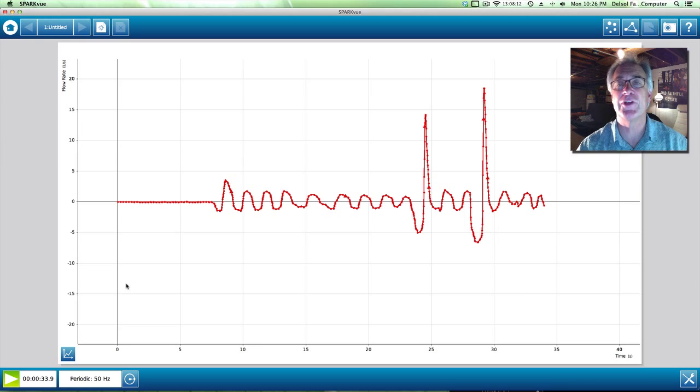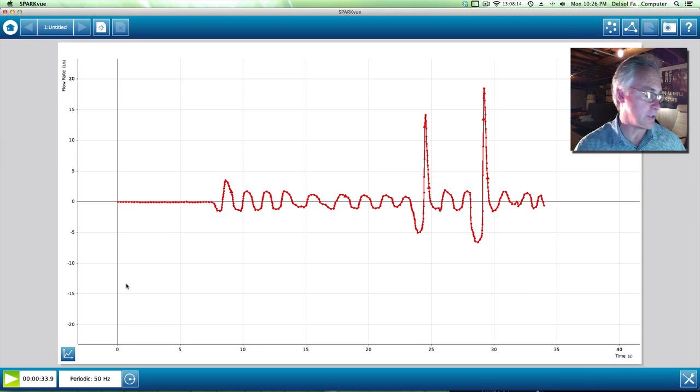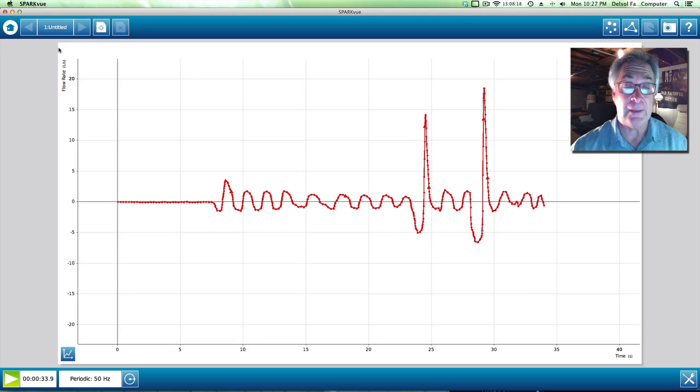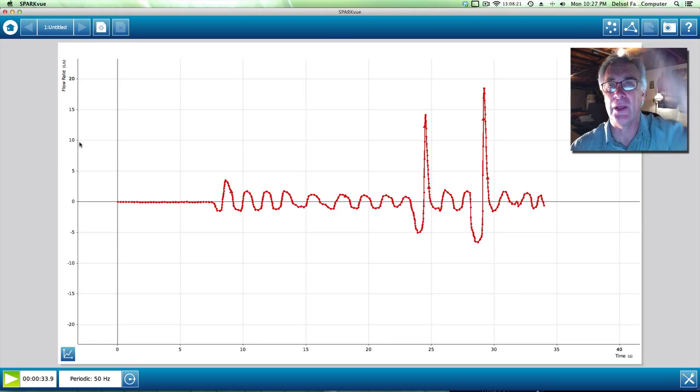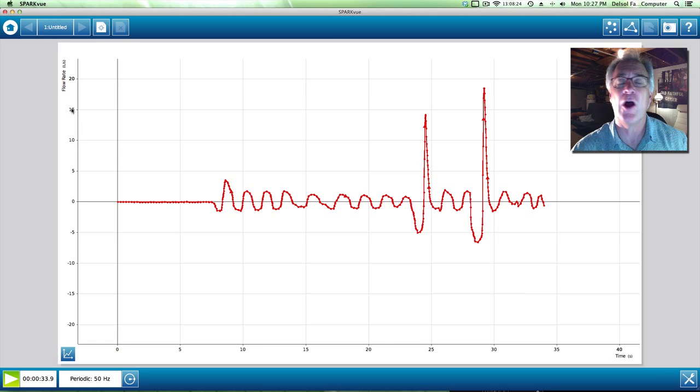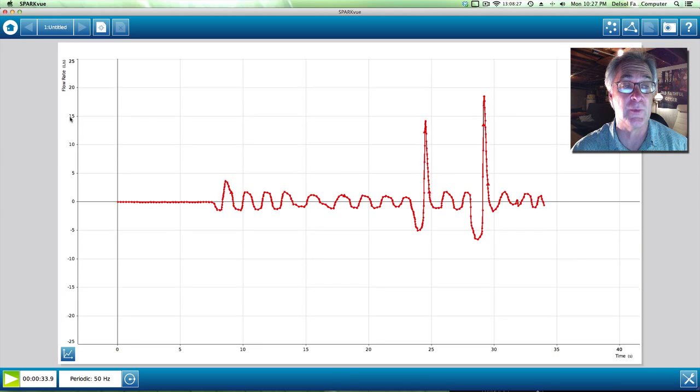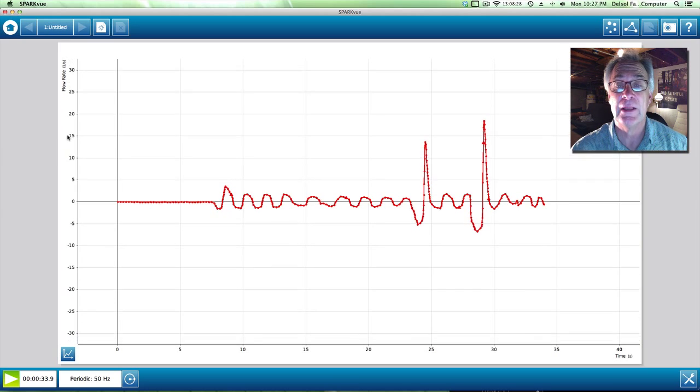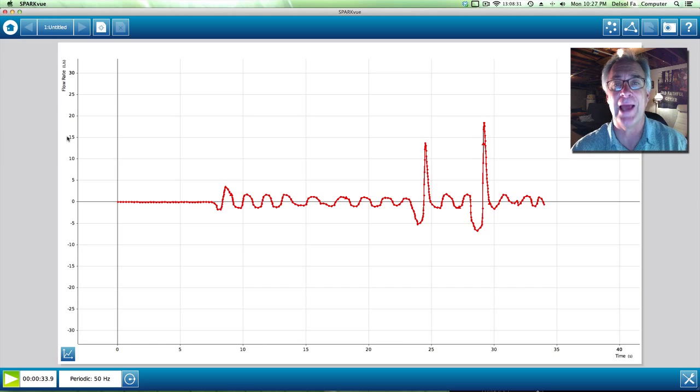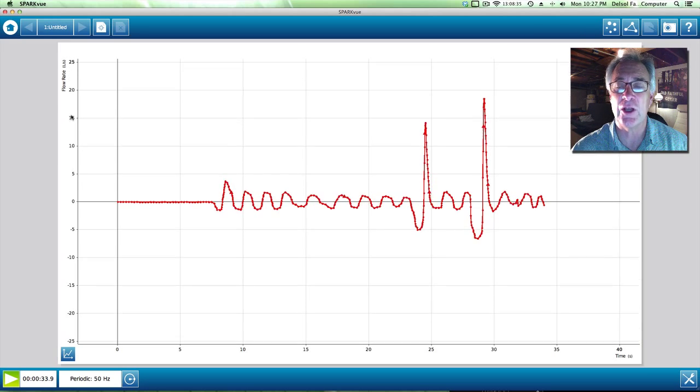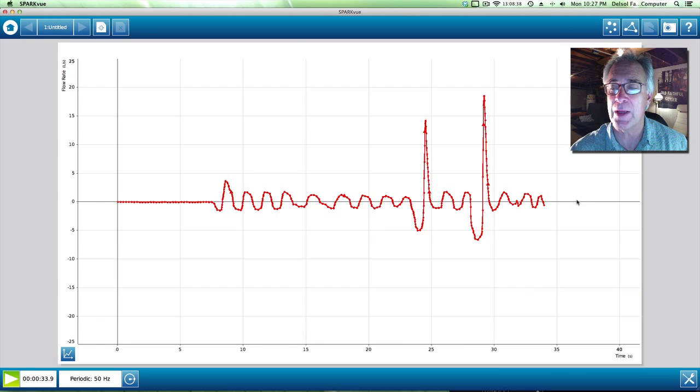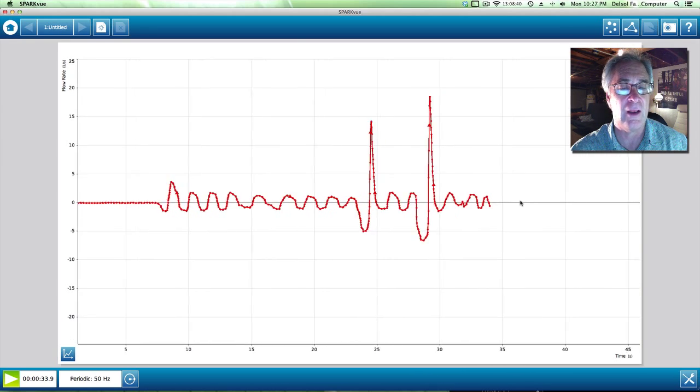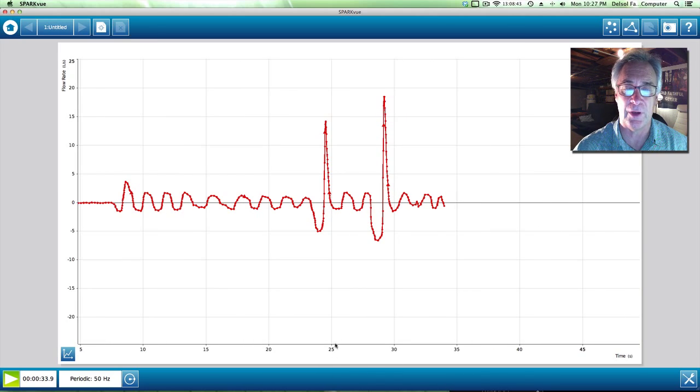All right, I've just done a couple of different things here just to show you what your graph ought to look like. Now, what I did was when I had those really big waves, I clicked on the flow rate or the y-axis and dragged those numbers down so that the amplification wasn't going to outstrip the content on my graph. So I'm going to just enlarge it a little bit. And, of course, I'm going to move it by clicking that line and moving it over so you can see what's going on.